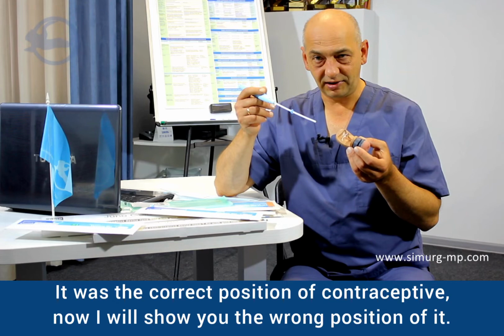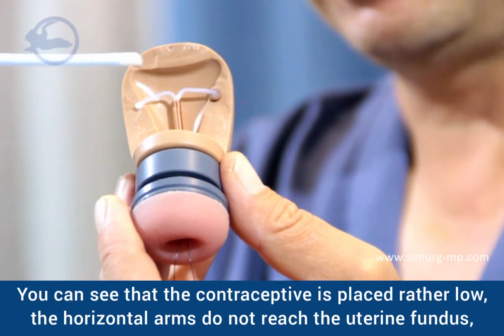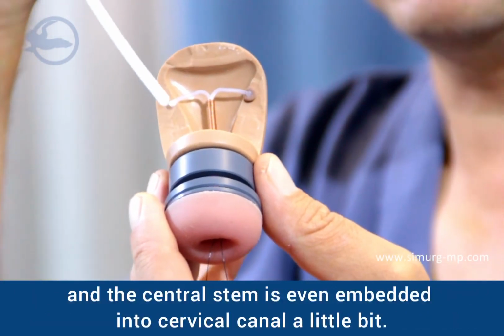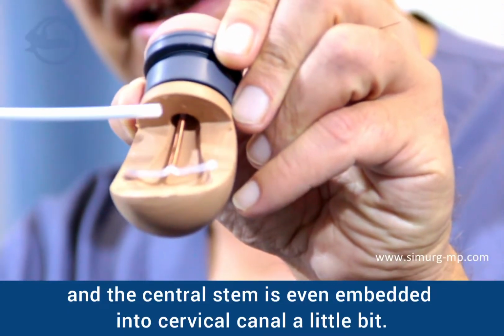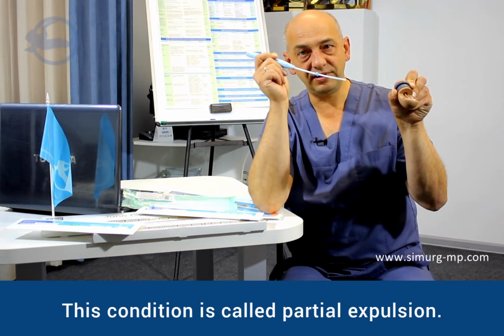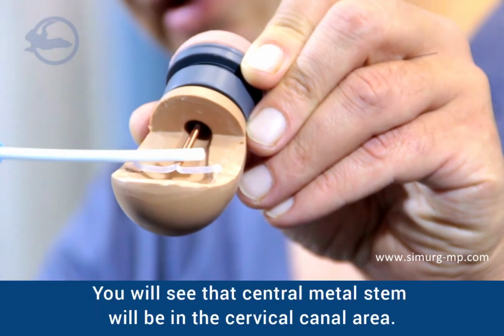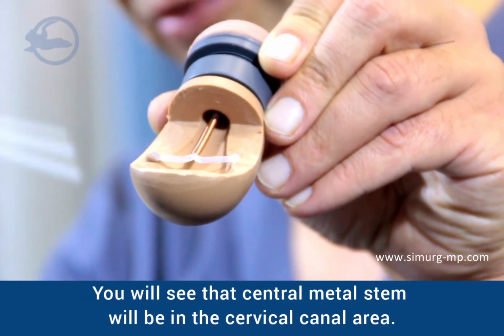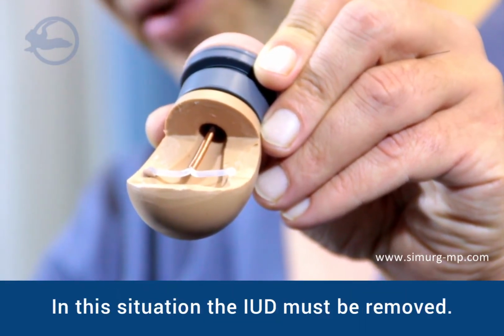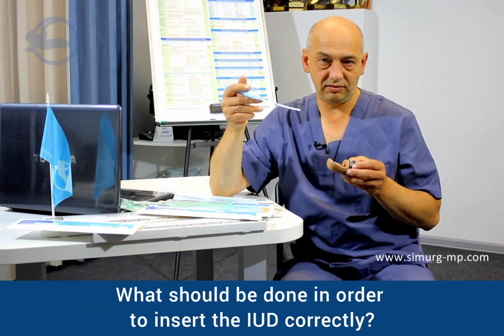Now I will try to show you the wrong position of it. You can see that the contraceptive in this situation is placed rather low. The horizontal arms do not reach the uterine fundus, and the central stem is even embedded into cervical canal a little bit. This condition is called partial expulsion. It is diagnosed rather easily. You just need to do the ultrasound investigation. You will see that the central metal stem will be in the cervical canal area. In this situation, this IUD must be removed. What should be done in order to insert the IUD correctly?